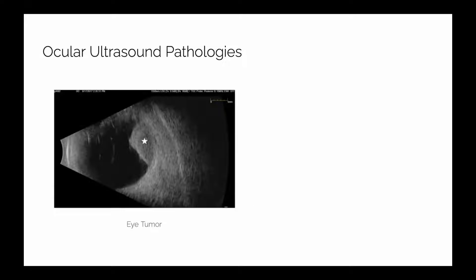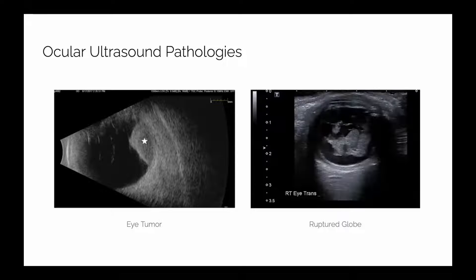A couple more pathologies we can find: if you have masses in the eye, like this tumor - this is actually a choroidal melanoma - you can detect masses within the eyeball as well. And this is kind of your worst case scenario: ruptured globe. Pretty much your eyeball is ruptured.